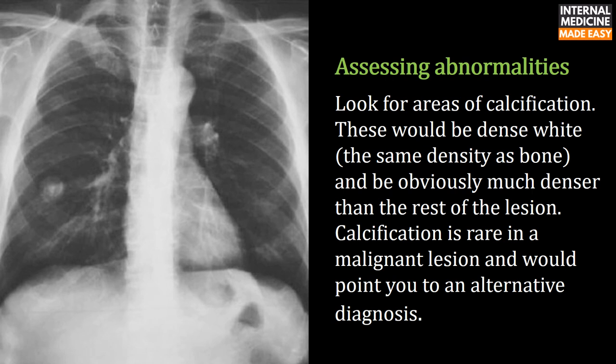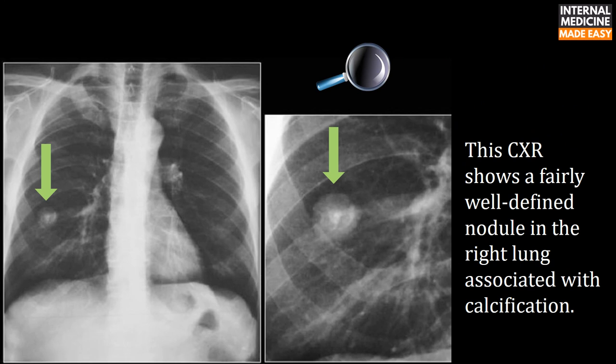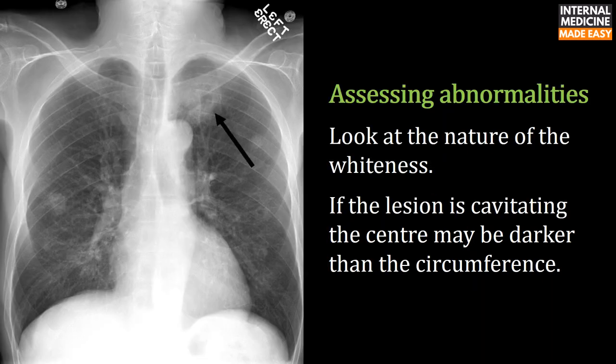Look for areas of calcification. These would be dense white, the same density as bone, and obviously much denser than the rest of the lesion. Calcification is rare in a malignant lesion and would point you to an alternative diagnosis. This chest X-ray shows a fairly well-defined nodule in the right lung associated with calcification.